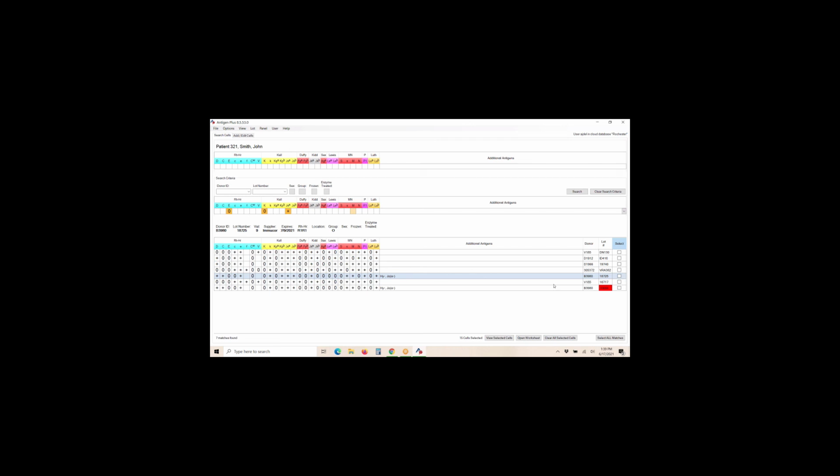As soon as you select this cell here, that's JSA, that we search for JSA, you'll notice that now the JSA turns a light orange. That means if that cell's negative, then it will be excluded.